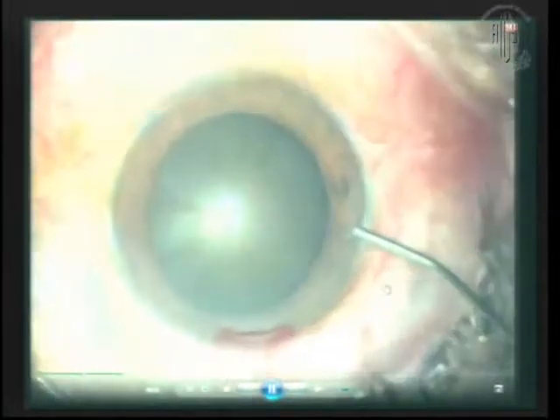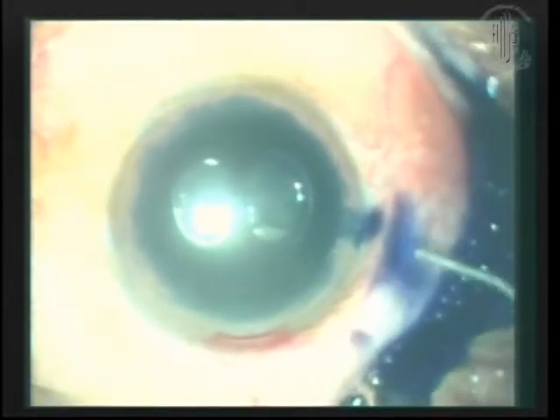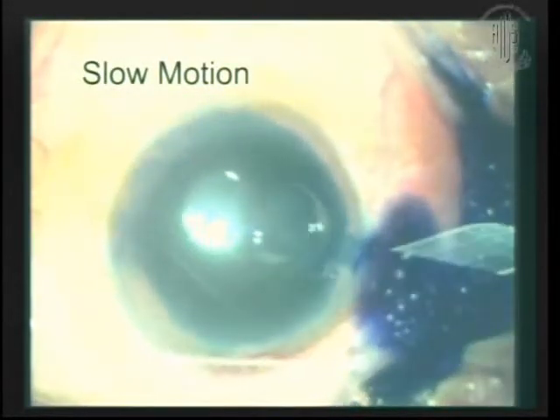Now this is a case where we ran into a bit of a problem. So same air into the anterior chamber, trypan blue, and now see what happens when the cannula is exiting the eye. The air escapes a little, and there, I have a nick. Now this is going to cost me very dearly. Let's look at this in slow motion. There, the air escapes, and there's a nick.